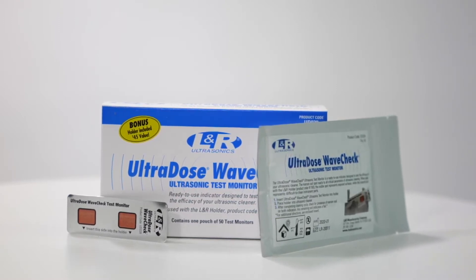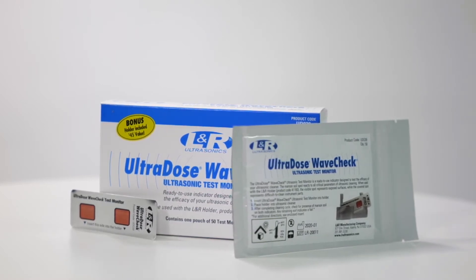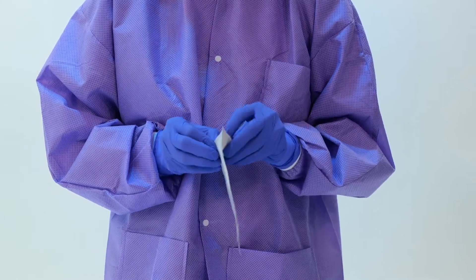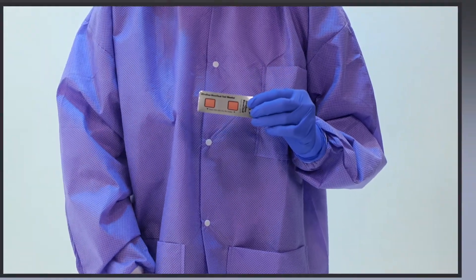The material used on the WaveCheck strip mimics the blood proteins on the instruments after use. Used in conjunction with the proper ultrasonic cleaning solution, WaveCheck monitor strips will confirm your unit is performing properly. WaveCheck is a quick and easy test.